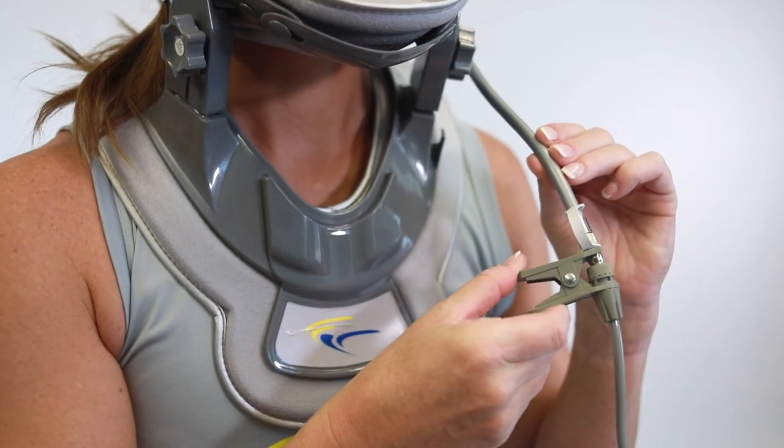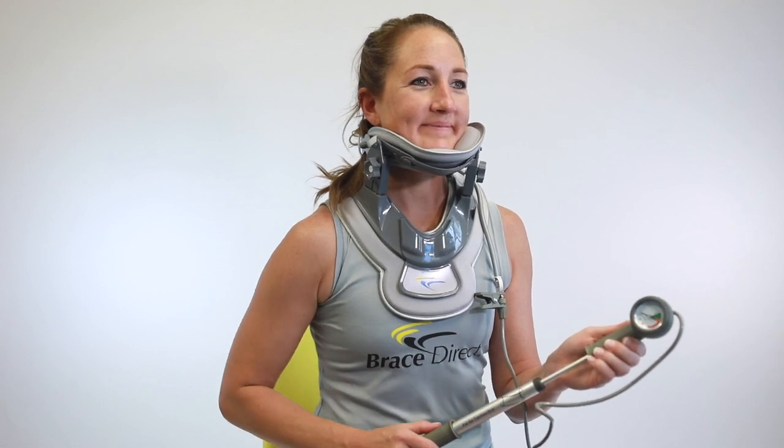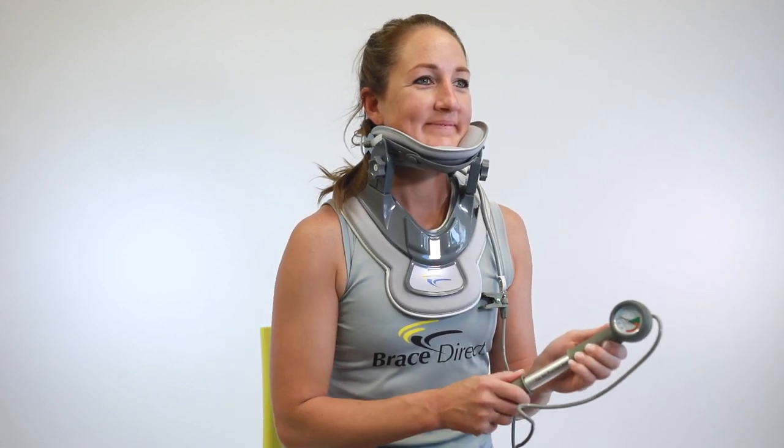Attach the air pump clamp to the valve. Use the pump to inflate the collar to your comfort level. Leave in place 10 to 20 minutes, or as advised by your physician.